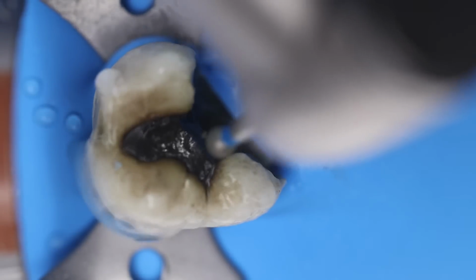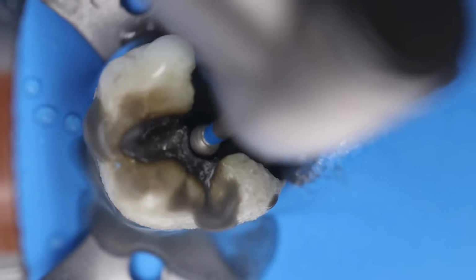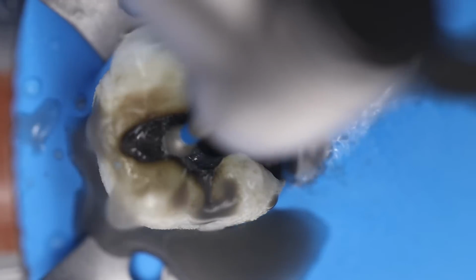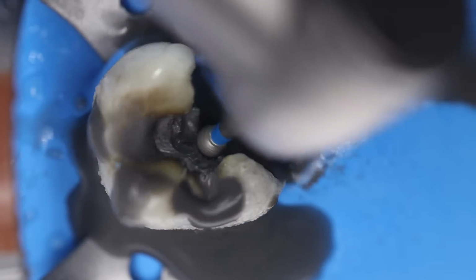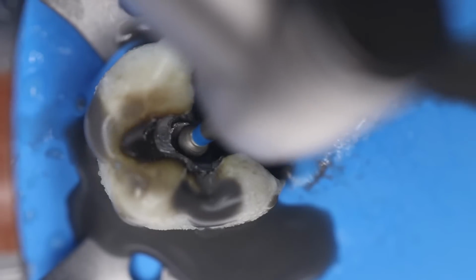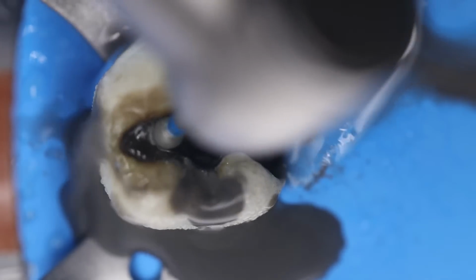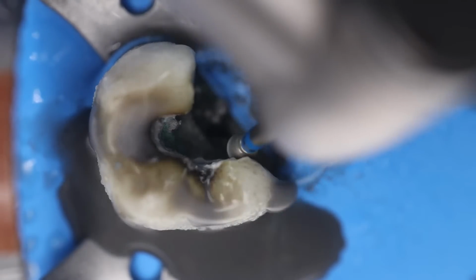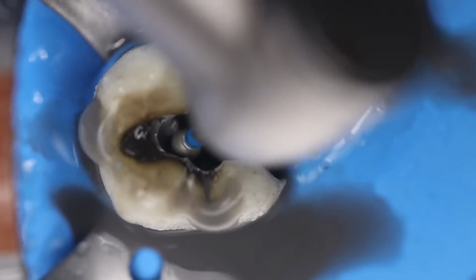Hope you are able to visualize the things. We are just removing the old restoration first. Remember, if you have any doubts, you can always go slowly.